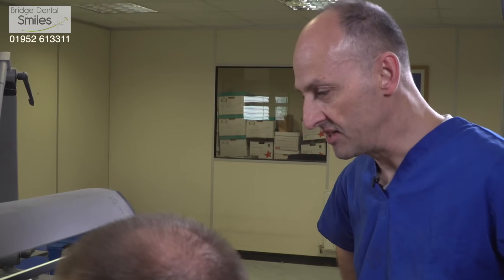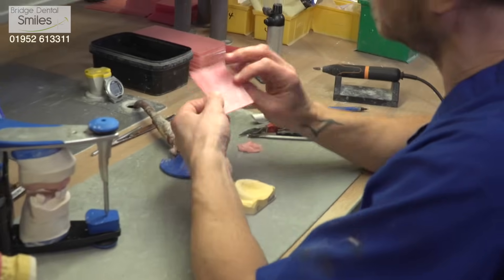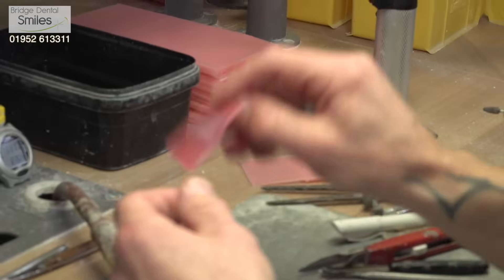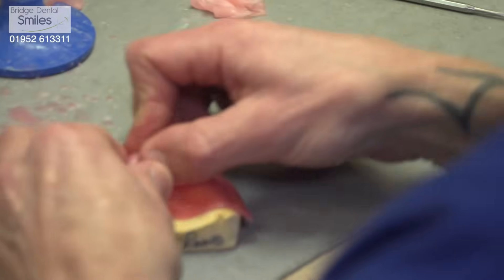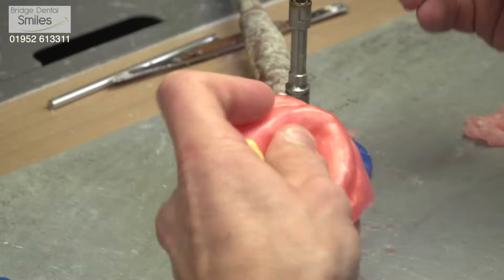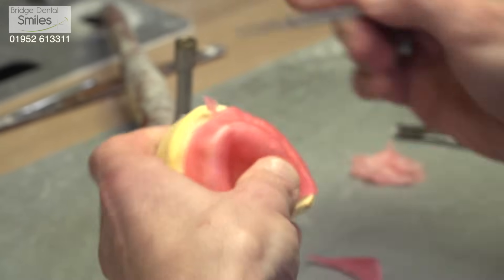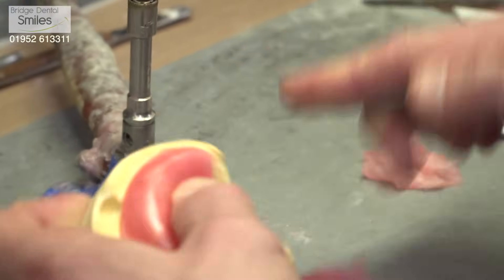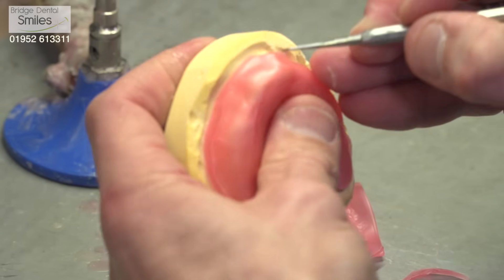The next stage in the process is making the bite rim, which enables the dentist to register the way in which the patient's jaws come together. What Neil's doing is melting the wax, which is now going to fit over the cast that we prepared earlier. We start off with a large piece which forms the base plate, trim that down to the correct shape taking care that it goes over the anatomical features of the mouth — the muscles — and forms a good accurate fit so we get as much suction as possible from the bite rim. We're not extending it too far back because that might be uncomfortable for the patient.